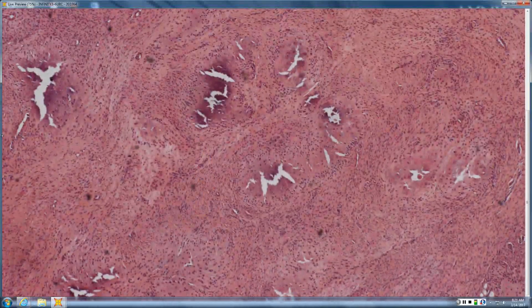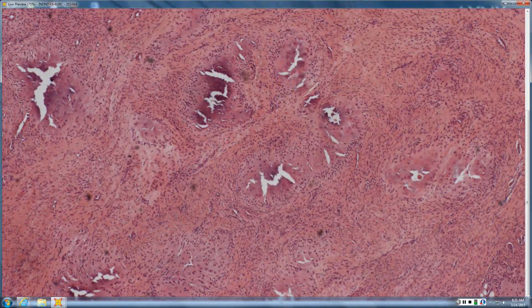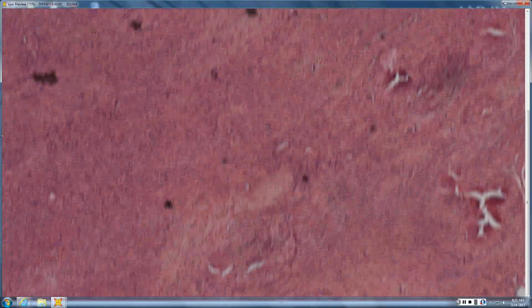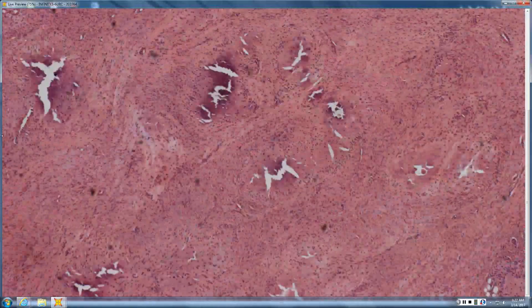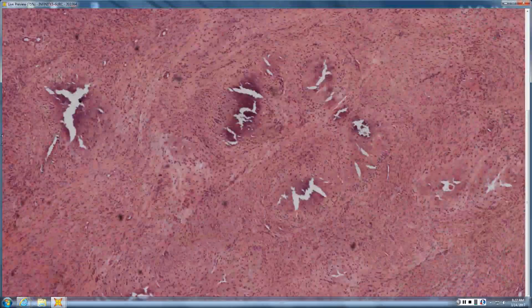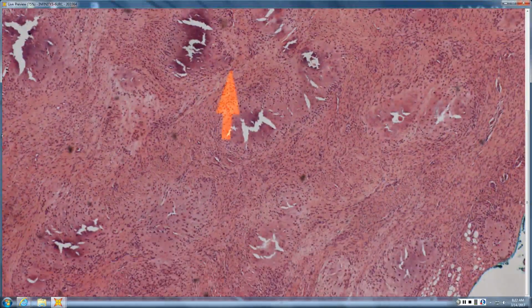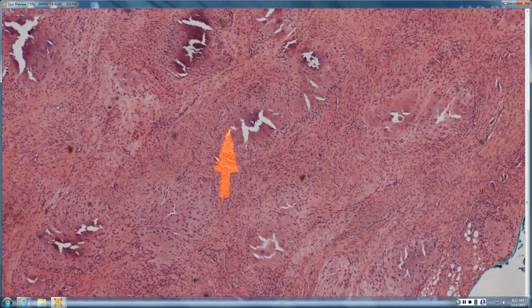So fibrous tumor and kind of palisades around these calcifying areas. Tends to occur in the aponeuroses. It's just a variant of, like, maybe a distant cousin, but the calcifying aponeurotic fibroma, again, very descriptive name.